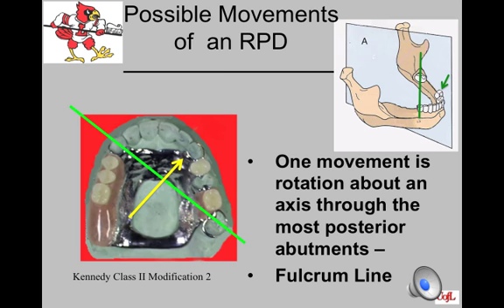For aesthetics, we might choose to clasp the second premolar, but if we're going to clasp the canine on the contralateral side of the arch, it just makes good sense to go ahead and clasp our canine. It also makes good sense because it is really the best choice of a tooth for our secondary abutment.